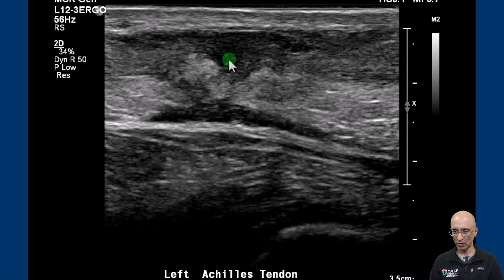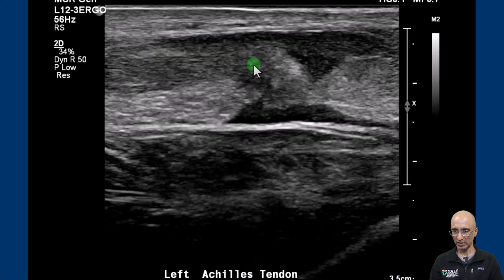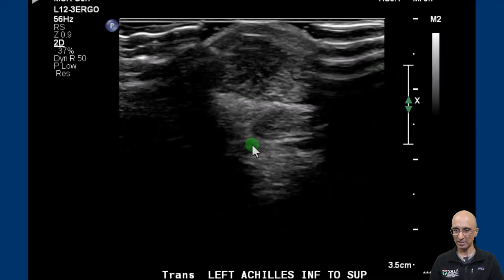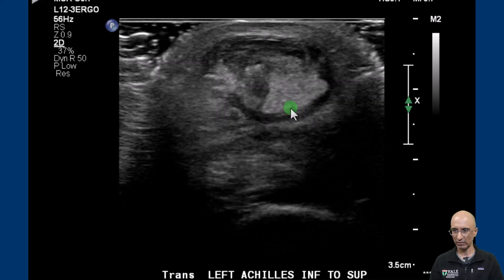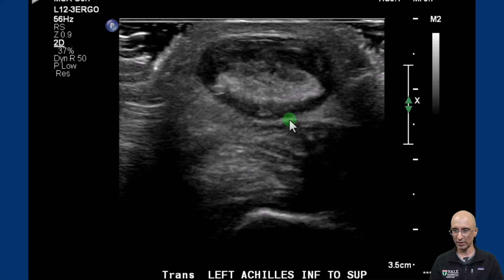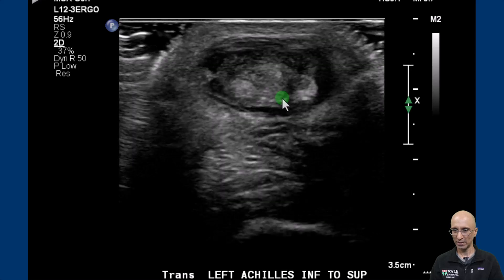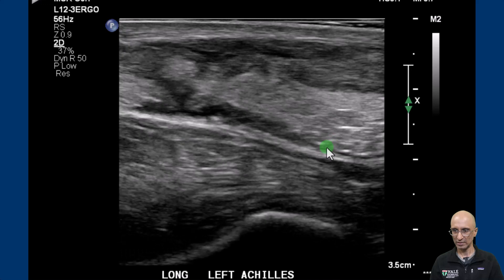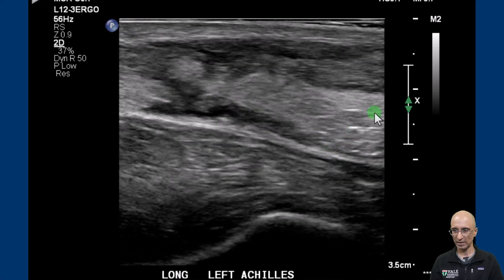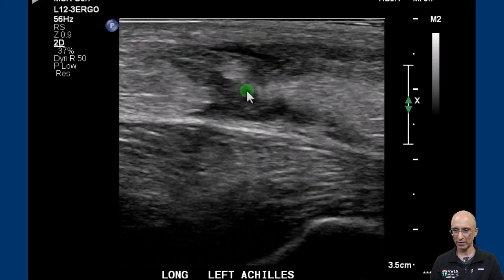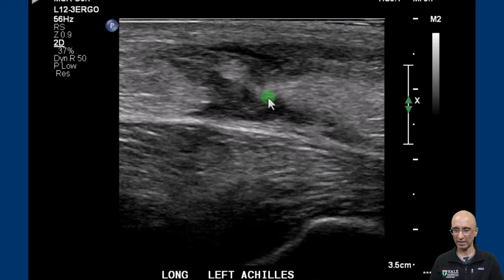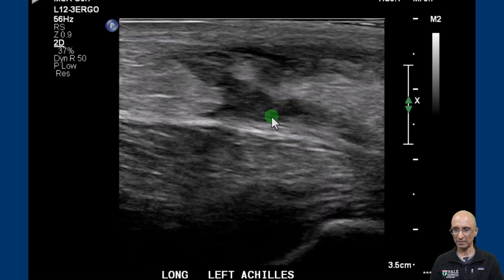There seems to be a little bit of soft tissue connecting the tendon in the region of the soft tissue defect. More images showing similar findings. On the axial dynamic images and longitudinal images, as I scan superiorly from the insertion point in the calcaneum, you can see the soft tissue defect with fluid and echogenic material, likely representing a combination of edema and blood products.